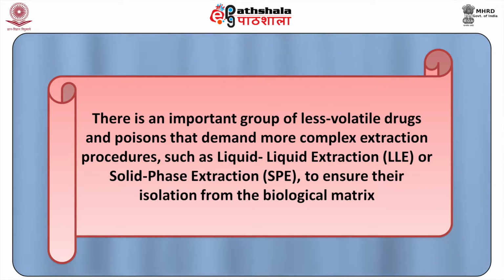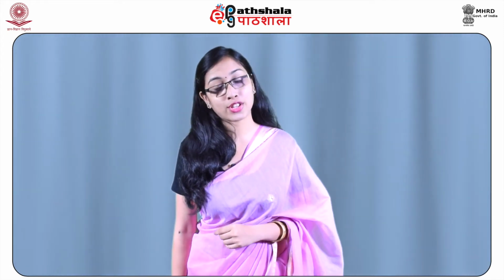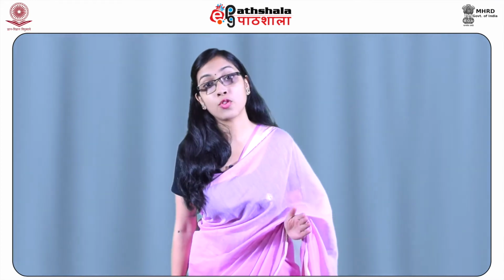However, there is an important group of less volatile drugs and poisons that demand more complex extraction procedures such as liquid-liquid extraction, or LLE, or solid phase extraction, that is SPE, so as to ensure their isolation from the biological matrix. In most cases, the appropriate preparation of the specimen is a fundamental precondition for successful sample extraction. Protein-free samples such as urine, or liquid samples with low protein content such as serum or plasma that are frequently used in clinical toxicology, are comparable to a purely aqueous phase, and therefore direct extraction can be tried also.